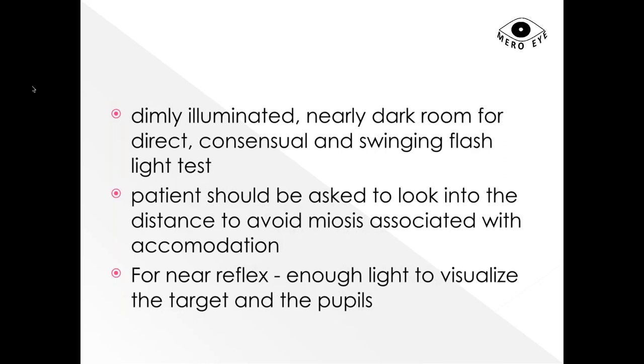Vance Hutchinson was a great physician. He said that examination of the patient starts right as the patient enters the room. For us ophthalmologists, or even eye care specialists, we sit at the slit lamp, and often we don't use a torchlight. But a simple torchlight examination of the pupil can give us a vast sea of knowledge, not only about the status of the eye, but also about the neurological status of the patient. So a torchlight examination of the pupil is a very important part of examination.